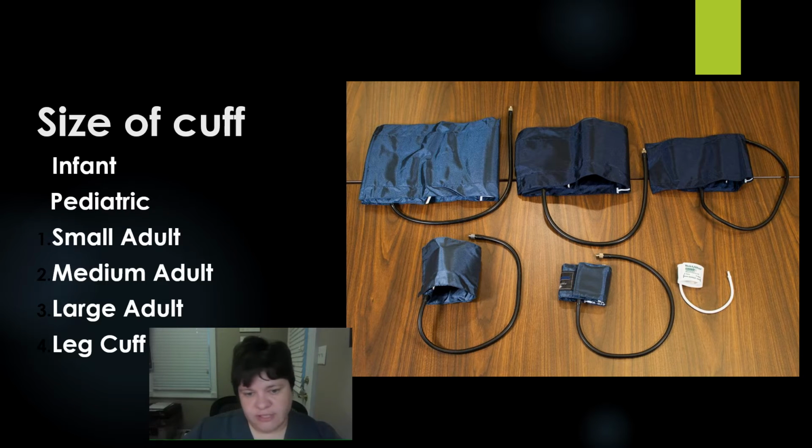Now, I know earlier I did not mention taking a blood pressure in the leg. You can, but you have to use the correctly sized cuff. When you get patients who are obese, who have very large arms, sometimes you have to use the large adult or even the leg cuff. But remember, it still has to fit on the arm.